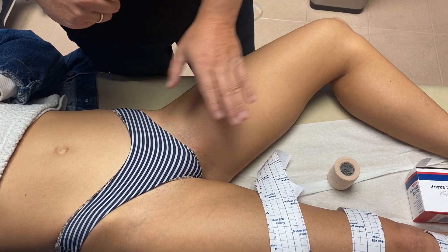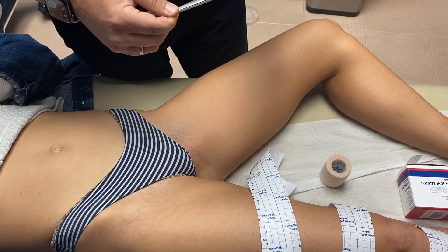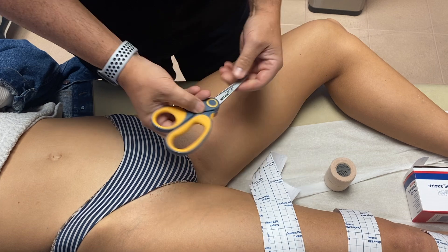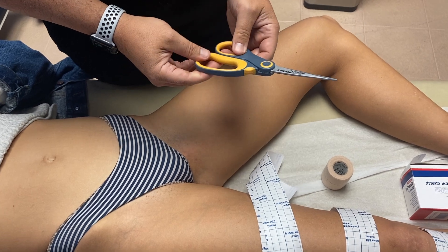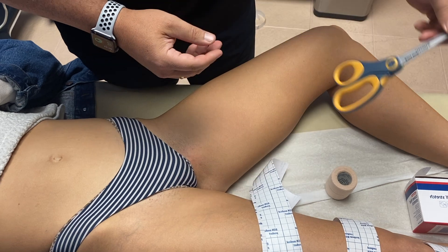We're going over the taping for the adductor longus tendon. This is the scissors we tend to use for taping, which is the Westcott nonstick Teflon-coated scissors. They're usually about $12 from Staples and you can get them online. They're much easier to use if you're going to be taping on a regular basis — the nonstick scissors.